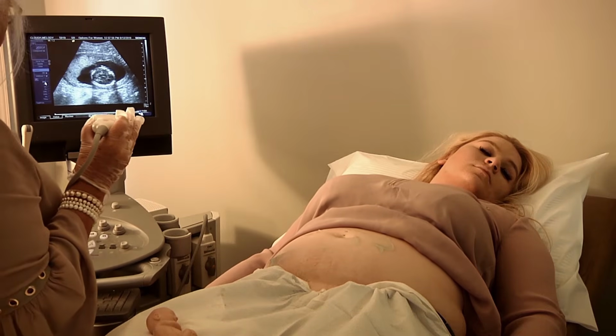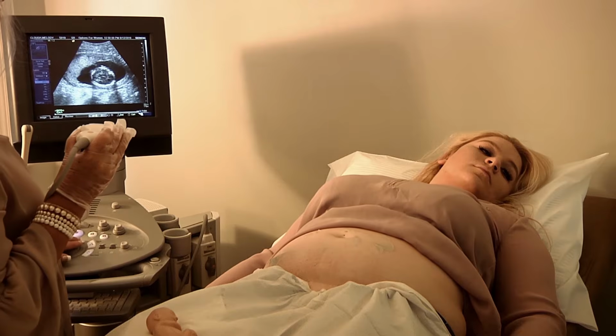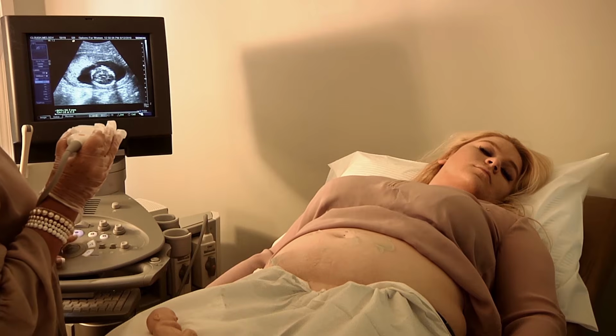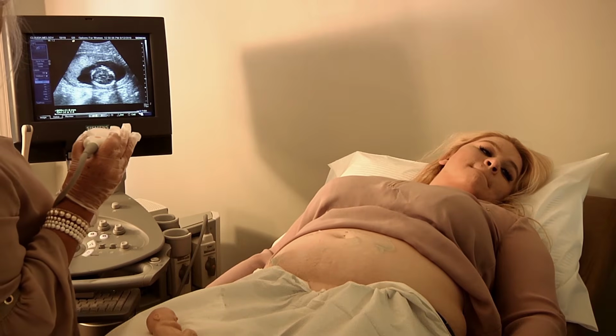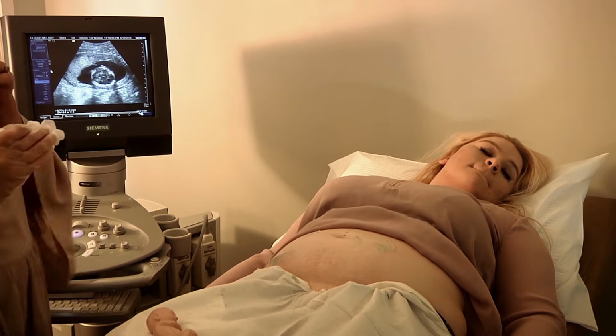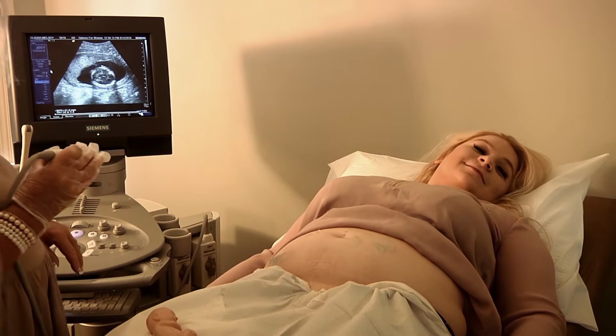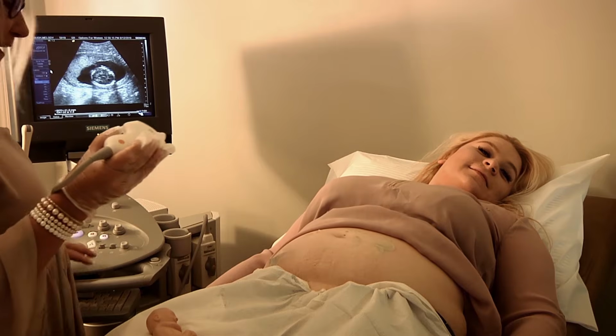So we're just going to go outer to inner. And this measurement, we're getting you 18 weeks, 3 days. So we'll take a couple measurements and get the average for you. Okay? So we're going to go take that picture.